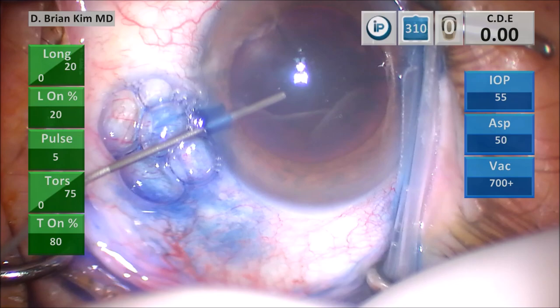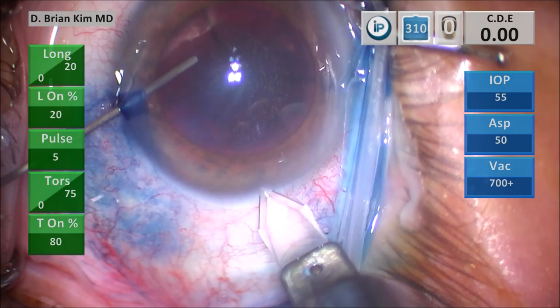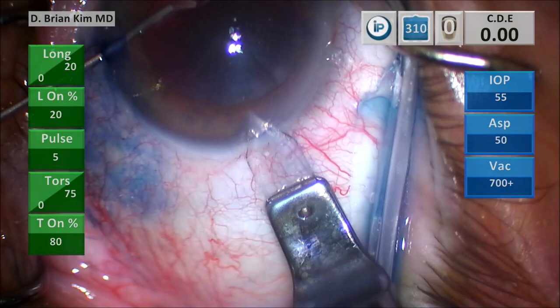This is a triplanar corneal incision. Using the cannula, I'm holding the eye steady. I make a vertical groove, place the blade into the deep part of the groove, tunnel through the cornea, and then use a cannula to turn the eye and enter.